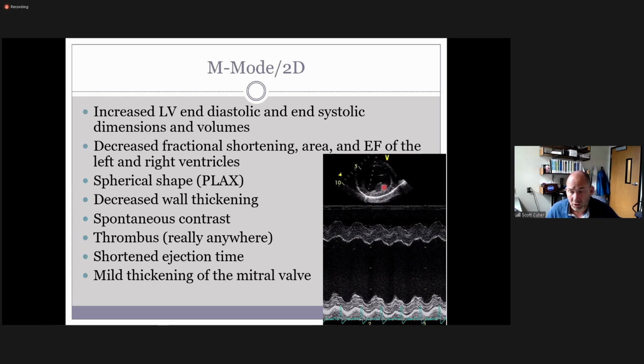This papillary muscle is also attached to the wall, and if they swept up closer to the mitral valve, this would be free floating, and then you'd be able to make that distinction. So this actually isn't the best measurement representation, even though it does measure big. Okay, it's not measuring as big as it actually is. So as you're doing your measurements, just be cognizant that we're trying to get the biggest dimension that's actually perpendicular. Even though it does show that it's large, which we do want to show, it's not showing it as large as it actually is.